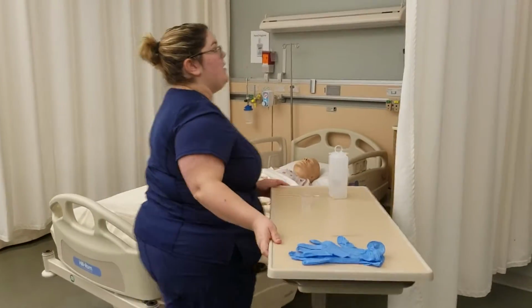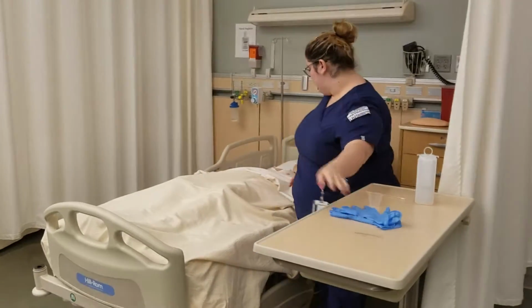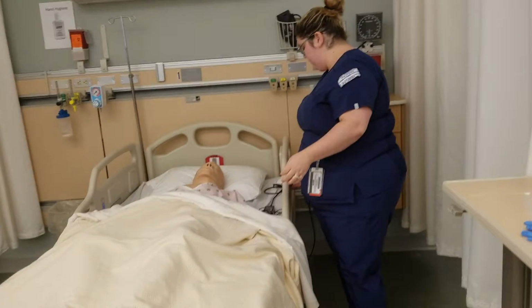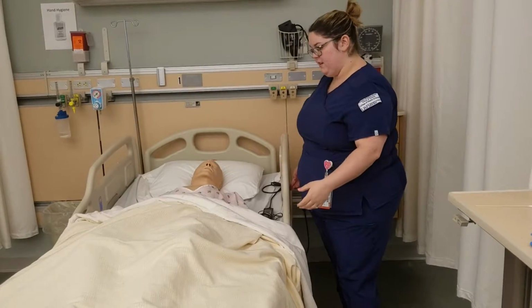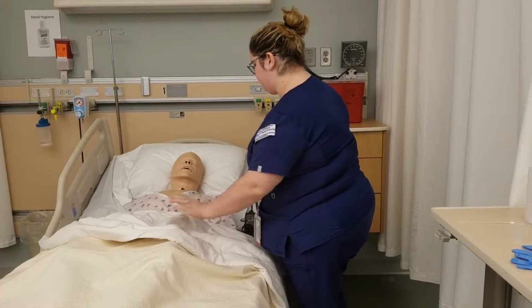Knock, knock. I'm going to provide privacy. And I'm going to raise the head of my patient's bed to prevent reflux after I give them their medication.